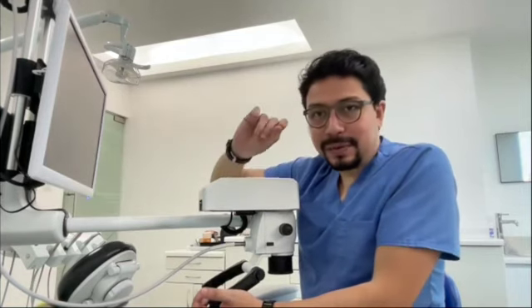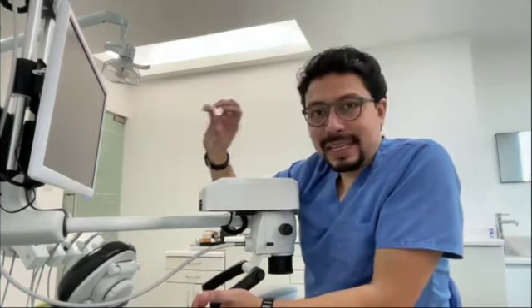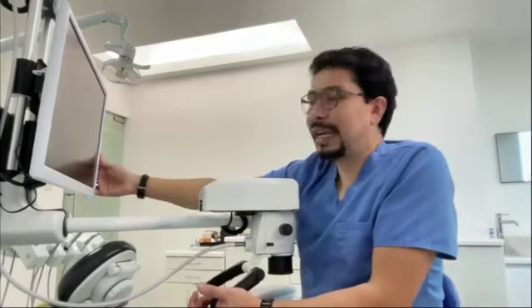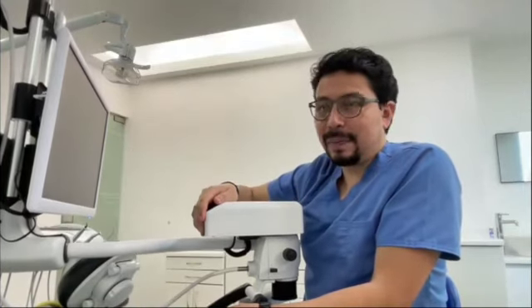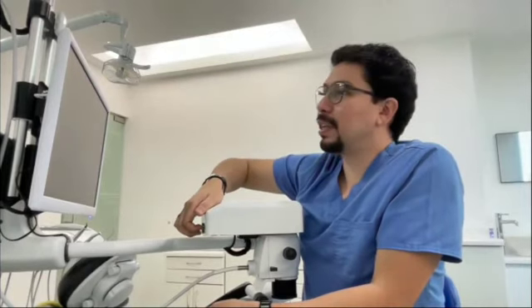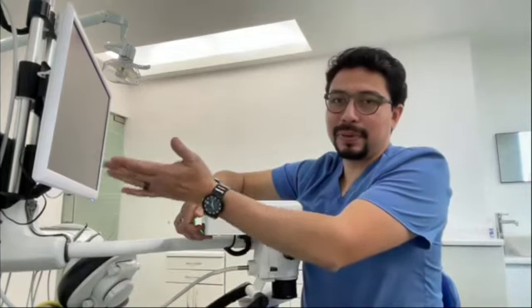This makes it easier to obtain the sharpest images on the screen. So you can change the vertical angulation of the screen, and you can also change the vertical position of the screen. It comes with a motorized system. As you will notice, the screen is going up now.